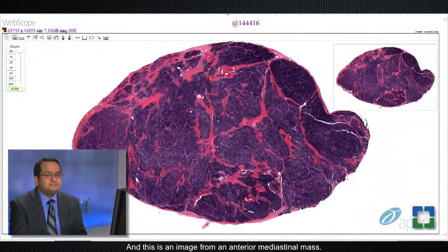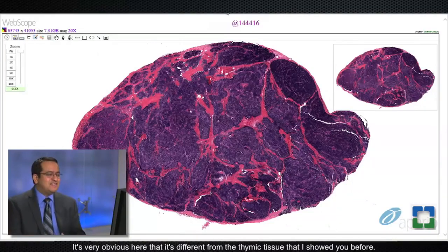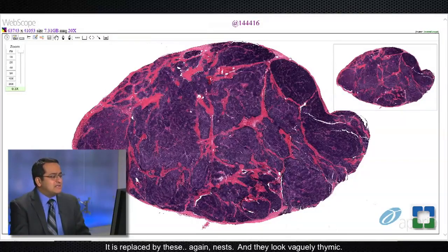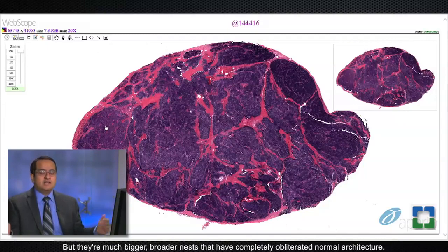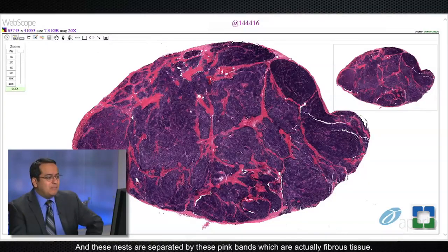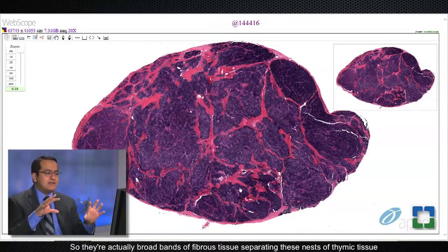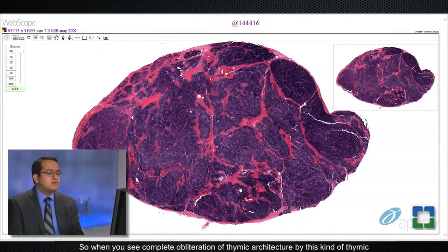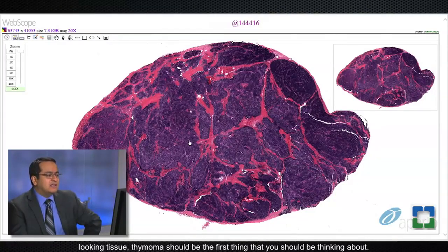Now let me show you another image from an anterior mediastinal mass — this shows abnormal architecture. It's very obvious that it's different from the normal thymic tissue I showed before. The entire architecture is abnormal; it is replaced by nests that look vaguely thymic but are much bigger, broader nests that have completely obliterated normal architecture. These nests are separated by broad bands of fibrous tissue — pink bands — and this is the classic low-power architecture appearance of a thymoma. When you see complete obliteration of thymic architecture by this kind of thymic-looking tissue, thymoma should be the first thing you think about.